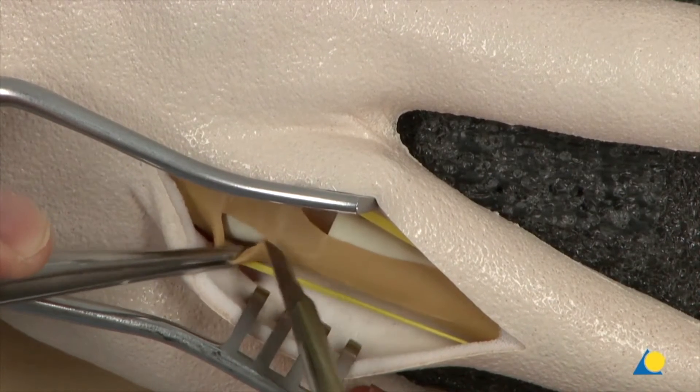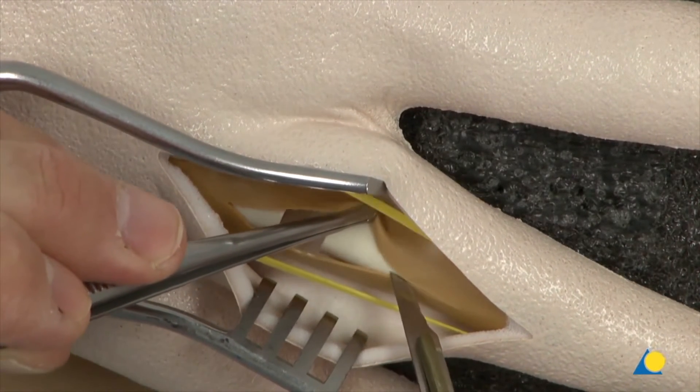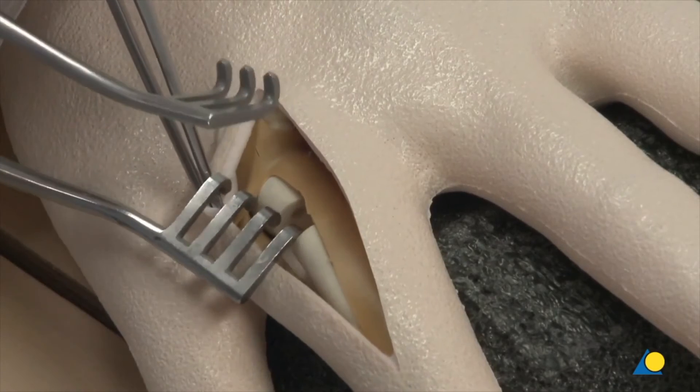The central slip of the extensor tendon is incised and the bone defect zone is exposed with retractors.